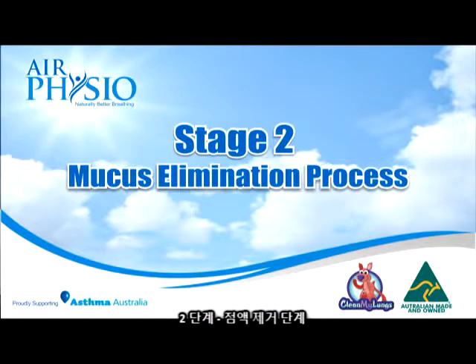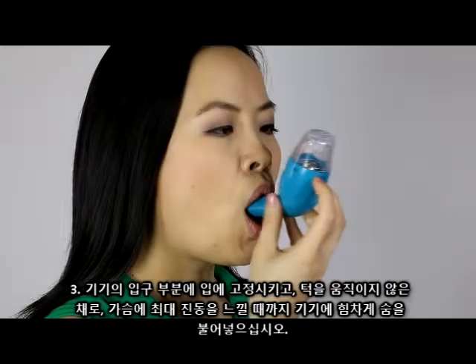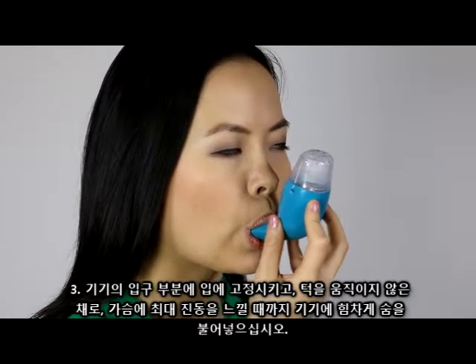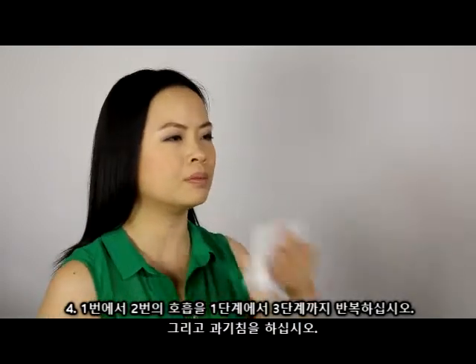Stage 2: Mucus elimination process. Step 1: Breathe in slowly, filling lungs completely. Step 2: Hold breath for 2-3 seconds. Step 3: Place the device mouthpiece into your mouth and breathe forcefully into the device. Step 4: Repeat these steps for 1-2 breaths and initiate a cough.